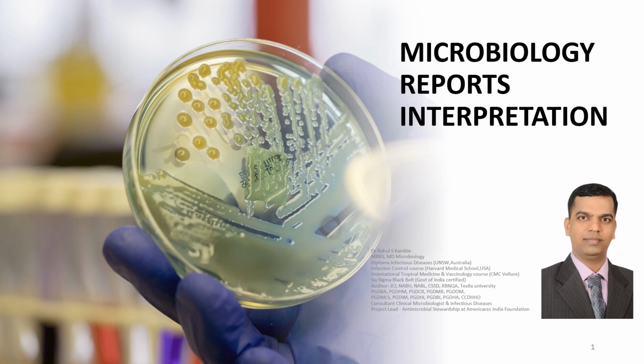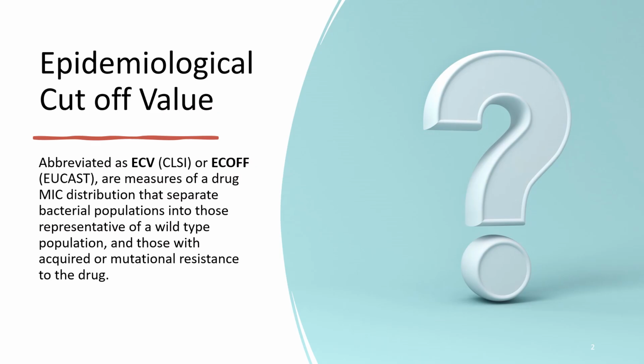Hello, let us continue with our session on how to interpret microbiology reports. So we have learned about the MICs and the breakpoints. Let us proceed to epidemiological cutoff value. Epidemiological cutoff value is also abbreviated as ECV or ECOFF.